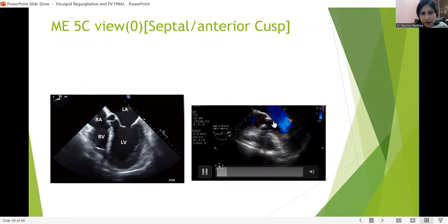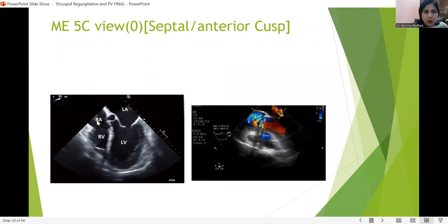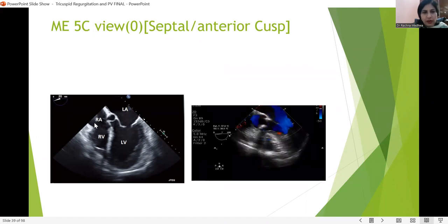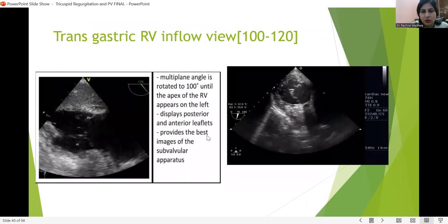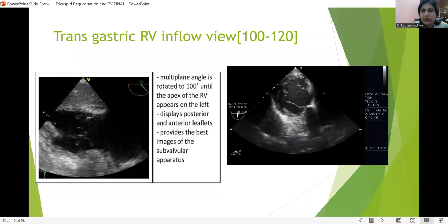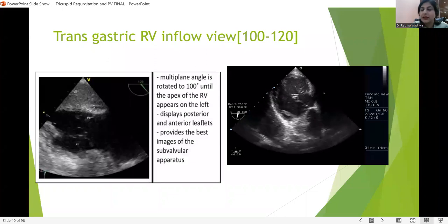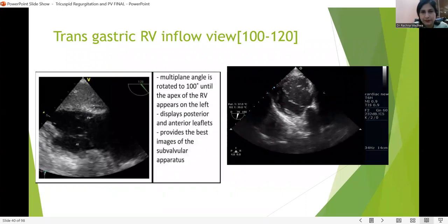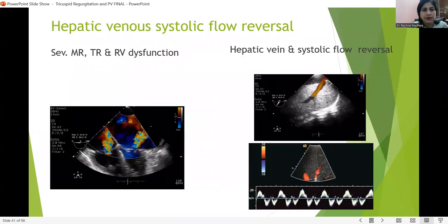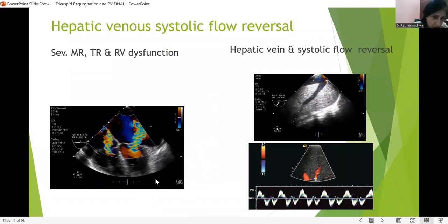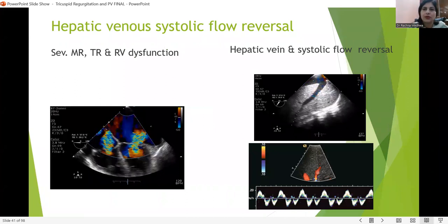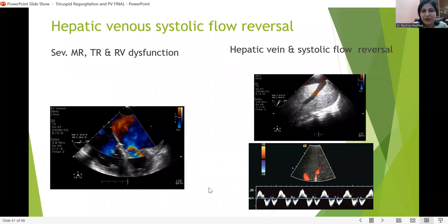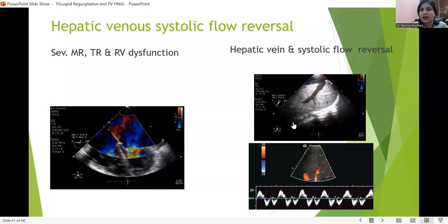The 5-chamber view can also give a good assessment of the tricuspid valve at times. In the transgastric view, the multiplane angle is rotated to 100 degrees. What is important is that we can see the apex of the right ventricle — which allows us to delineate the anterior and posterior cusps. This view also gives a very good idea of the subvalvular apparatus.